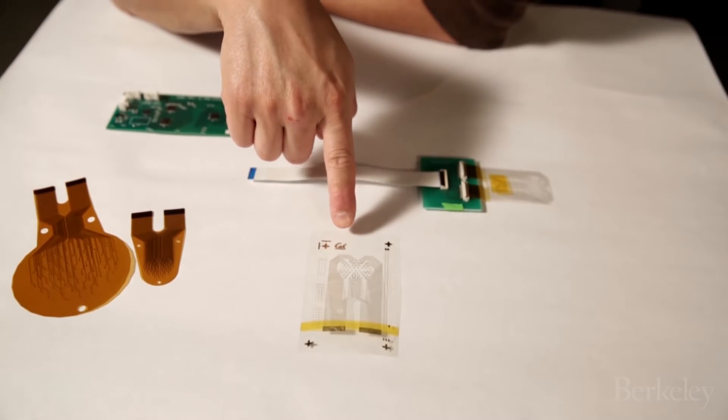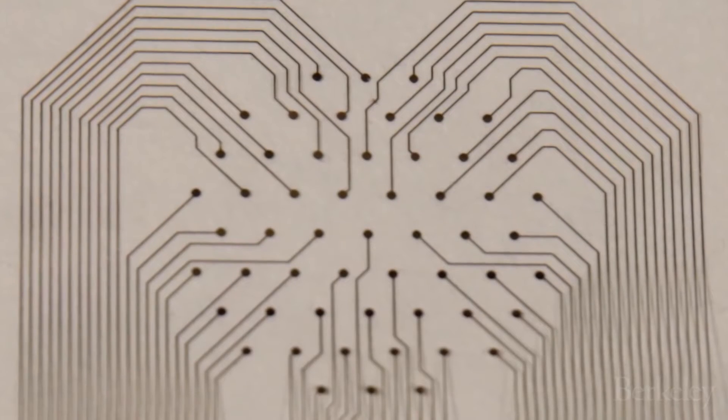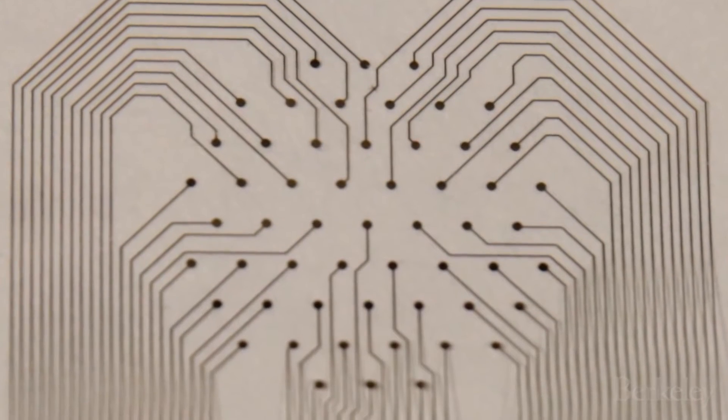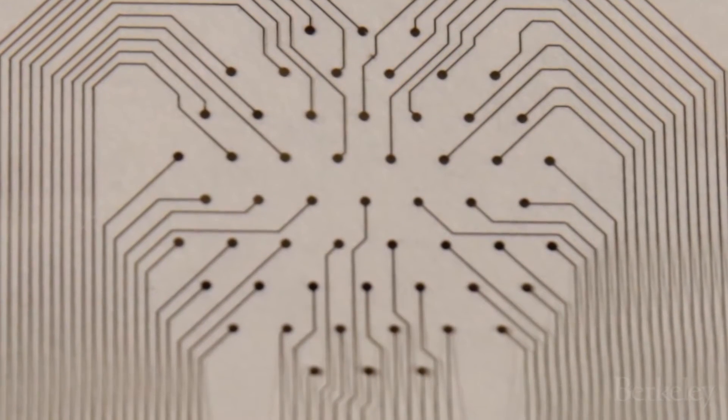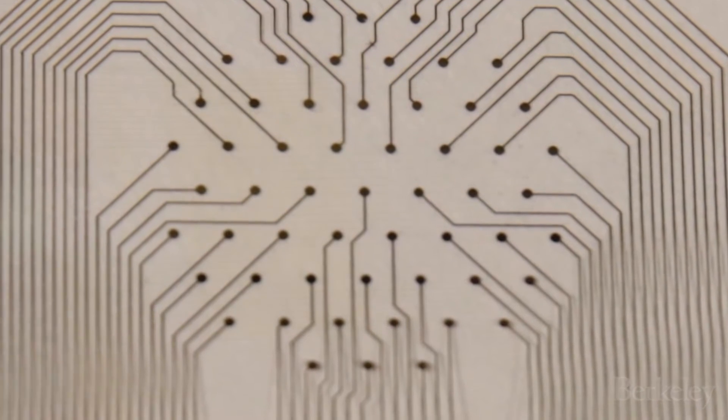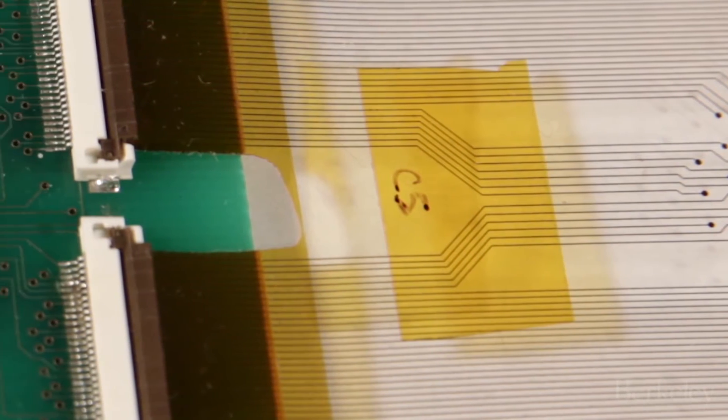This is the electrode array that would go on your skin and be part of the bandage. So what you see here is a bunch of little electrodes. Those are the little dots that you see right in the middle, clustered. And you can see that from each of those electrodes, buried underneath are little wires that extend back out to a connector.